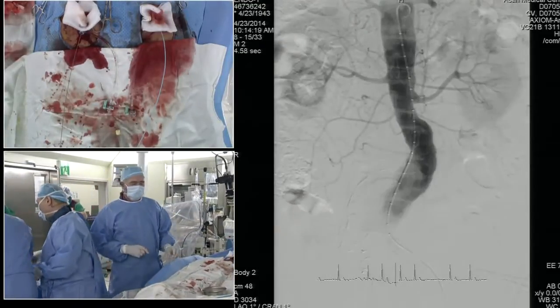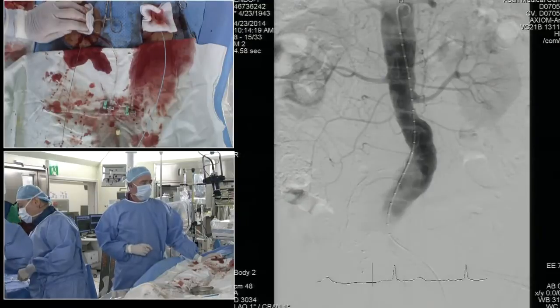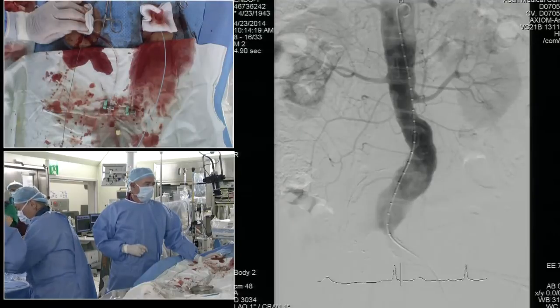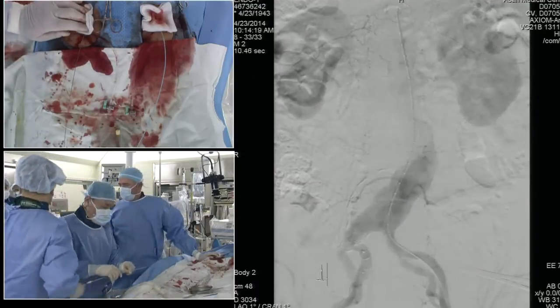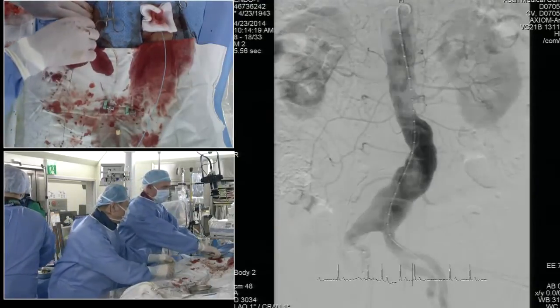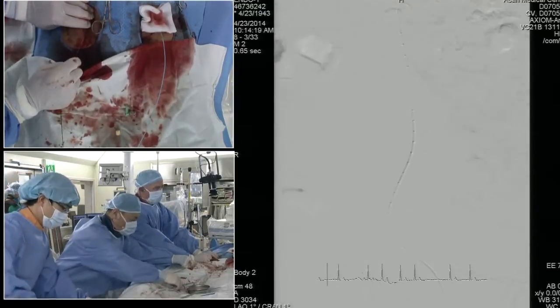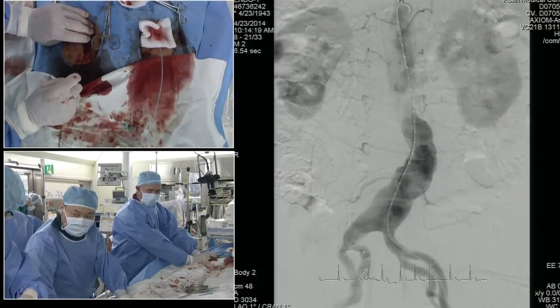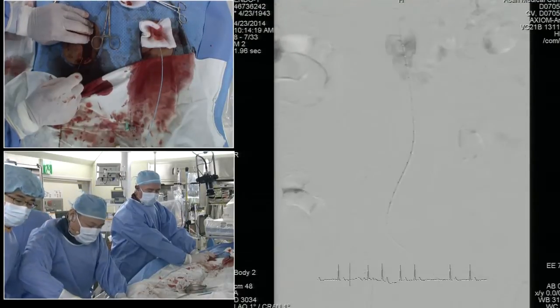John, this is Donghoon. So this patient's left common iliac looks over 2 centimeters. But if the left common iliac is also short, do you consider the sandwich technique? I'm sorry, I missed the last bit about that. Would we consider what? Sandwich technique. If the left common iliac is short, less than 2 centimeters, to stent into the internal to try and have a bifurcated graft, is that the question? Is that what you mean? I think that's the question, yeah.